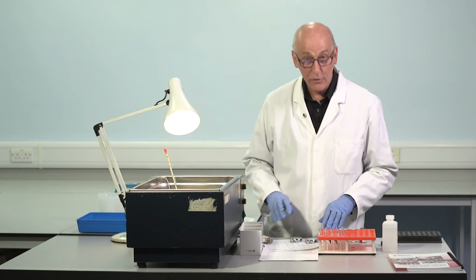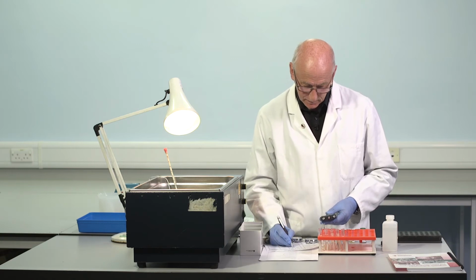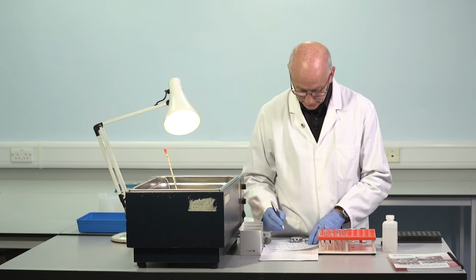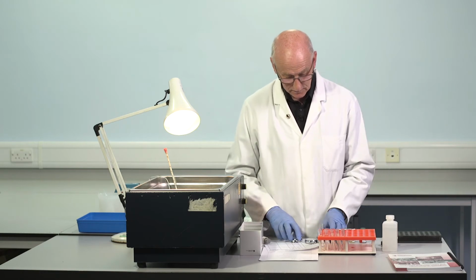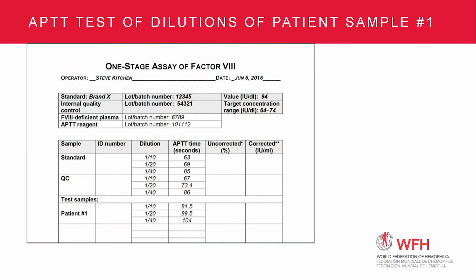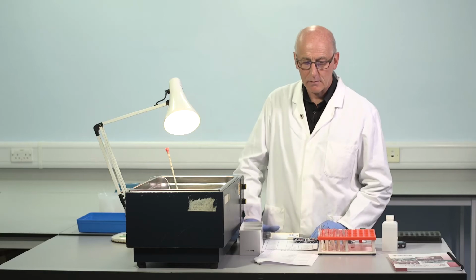Okay, so the first test sample, 1 in 10, 1 in 20, 1 in 40. 81.5 seconds, 89.5 seconds, 104 seconds. So already you can see longer times than what we've seen for the standard. Longer times, lower concentrations. So the second patient sample is underway, 100 microlitres of deficient plasma, each of 3 tubes, 1 in 10 dilution of test sample, first tube, 1 in 20, second tube, 1 in 40, third tube, and these are incubating. In a moment, when we reach the 3 minutes, we'll add the calcium.